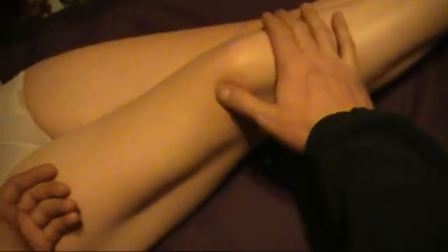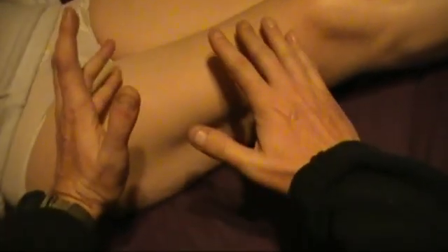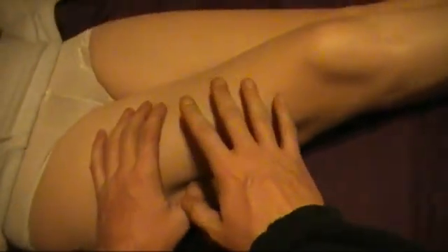When we do a surgical procedure, for example a knee replacement, we actually place a tourniquet up here to create a bloodless field in the lower part of the leg, and that's for hours on end. The major damages when utilizing a tourniquet are actually nerve and muscle damage, because instead of a wide band tourniquet like we'd use for surgical procedures, you're using a narrow band tourniquet.